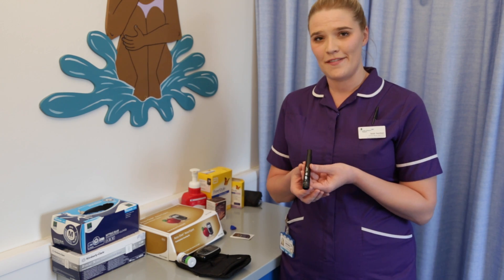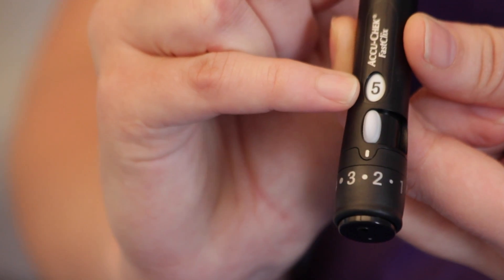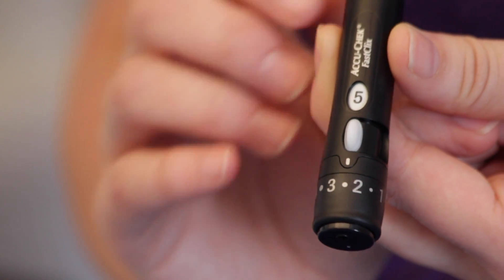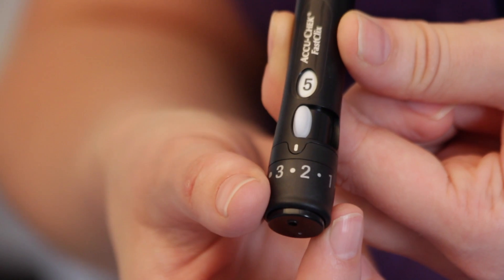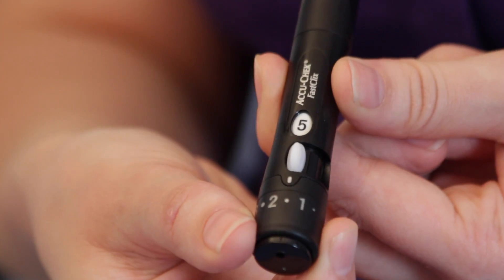The FastClicks lancet has six different needles inside. This number here on the front screen is how many needles are left inside that barrel. The number here on the bottom is the depth that the needle goes in. Somebody little would need a lot less than a fully grown adult, and the way to alter the depth of the needle is to twist around the bottom.